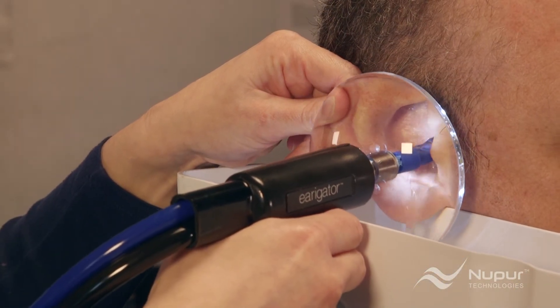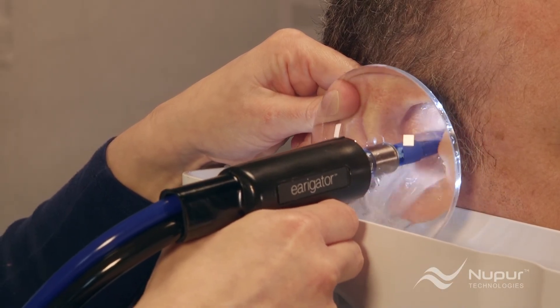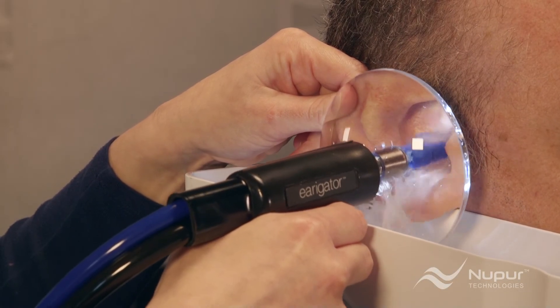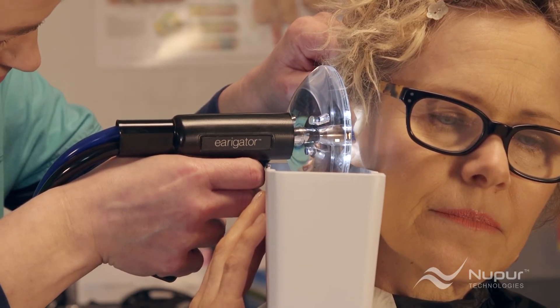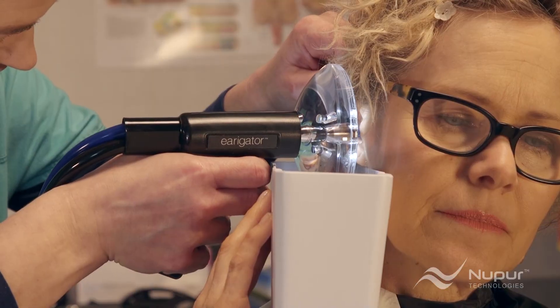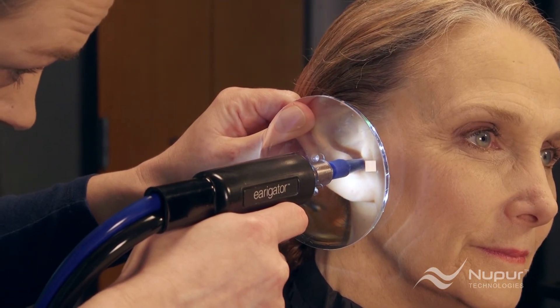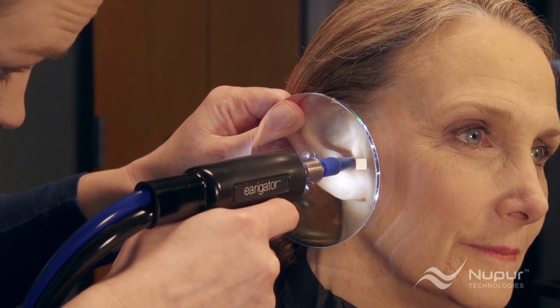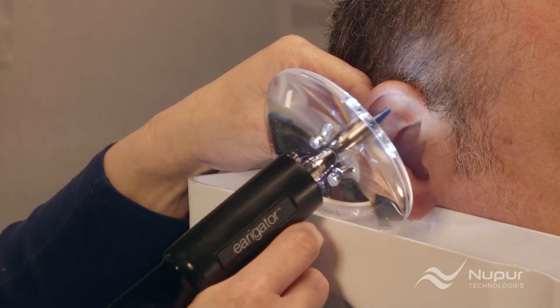If not, she quickly pulls the trigger to full flow and maneuvers the tip in multiple directions, using a circular motion in the ear canal. This helps to loosen and dislodge the earwax. The most effective results are obtained by utilizing the full flow with a fully depressed trigger. If the patient experiences any extreme discomfort, stop the procedure. Rachel may insert the tip slightly into the ear canal — no more than 4 to 5 millimeters, or about a quarter of an inch — always being careful not to push the nozzle to block the flow of water coming out of the ear.